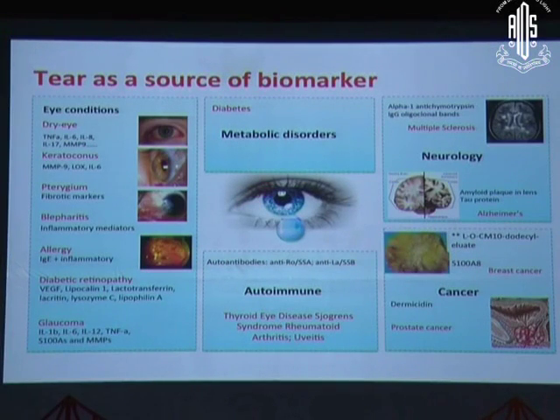This is just a summation of everything. Basically, from a tear Schirmer strip, you can find out multiple diseases. So it is not only dry eye, it broadens our horizons in evaluating and understanding multiple diseases just from a single Schirmer strip.